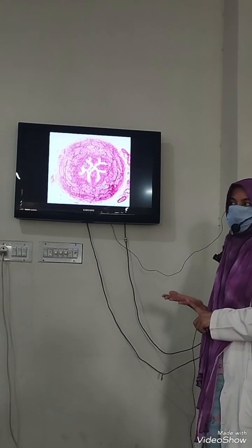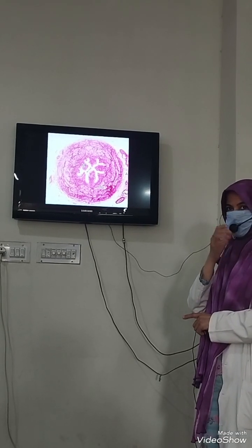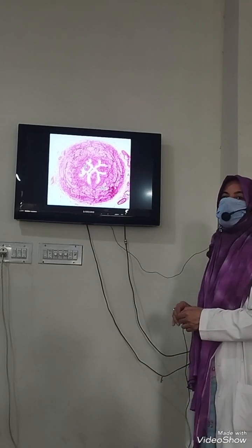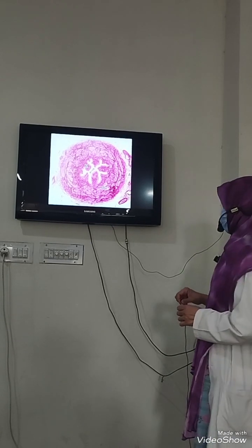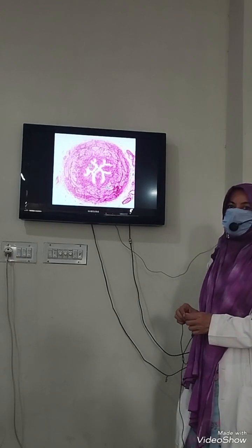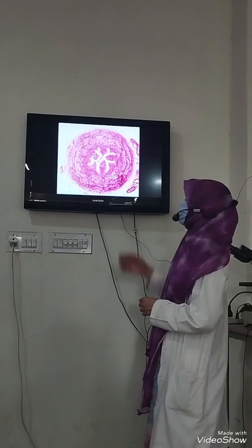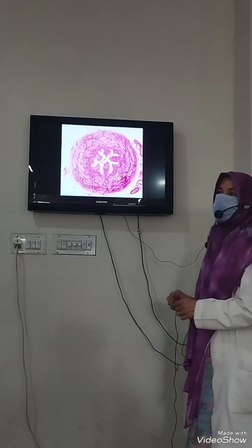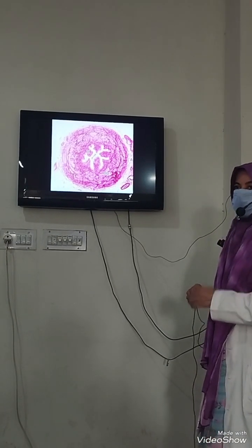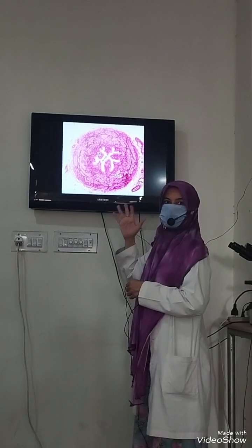We have got the fallopian tubes, right? We have got ductus deferens, if you talk about that. And seminal vesicle was there, but it was showing a labyrinthine sort of pattern. So, if we have to distinguish it, rather with the appendix as well, in that we got larger lymphatic nodules in the lamina propria, which is definitely not being shown here, right? If it was a ductus deferens or a fallopian tube, their lumen is comparatively smaller than that of it, right?